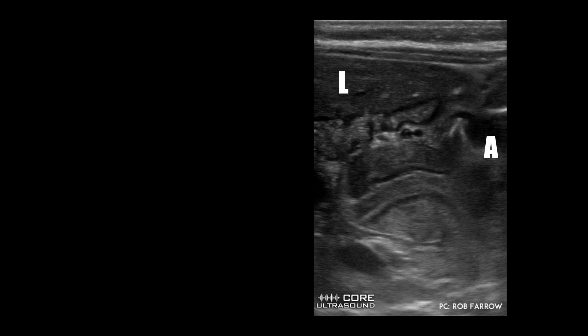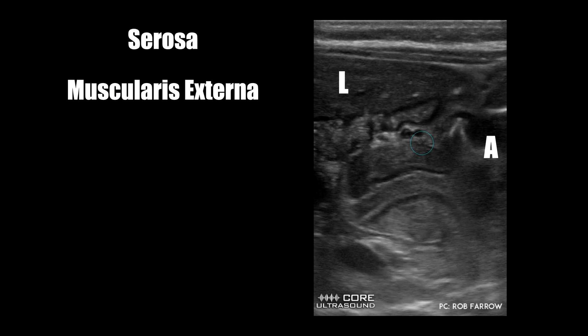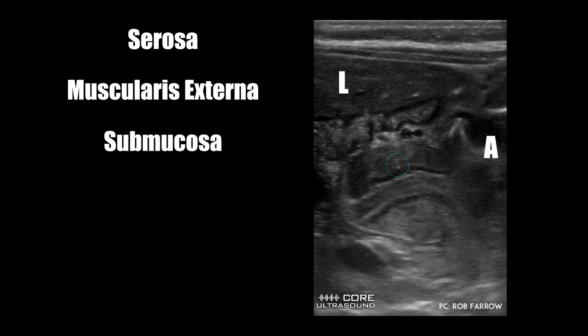Now that we've identified the pylorus on ultrasound, let's take a second and understand the anatomic layers of the pylorus on ultrasound to ensure we're getting the correct measurements. The first layer is the serosa — it's hyperechoic and on the outside of the pylorus. This is then followed by the muscularis externa, and this is the portion of the pylorus that actually hypertrophies when you have pyloric stenosis. This is the most important measurement you make for the diagnosis, so it's important to make sure you're not including the serosa or the underlying submucosa when you make that measurement.